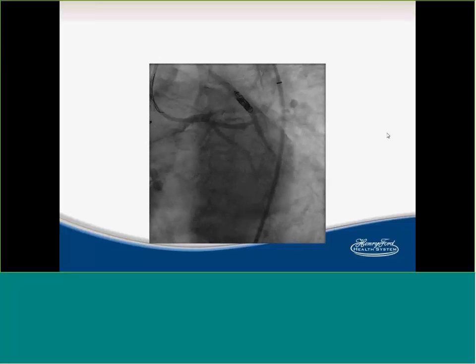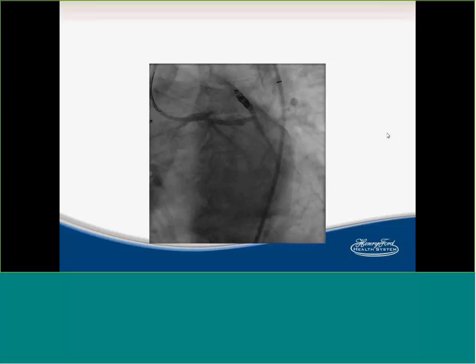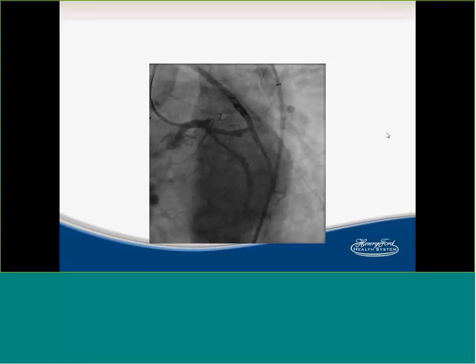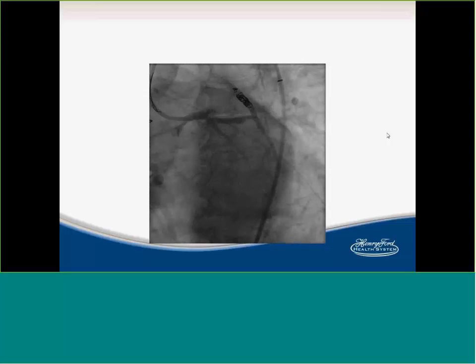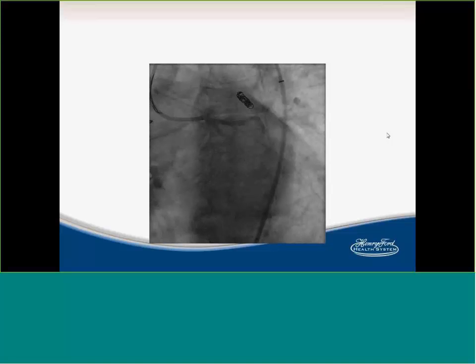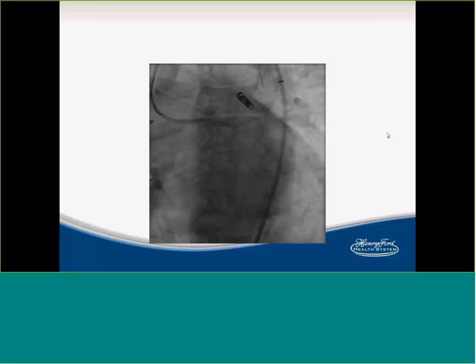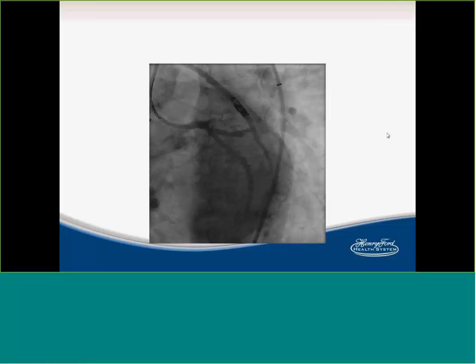Yeah, I think, Carl, this is a great example. I think you mentioned it before to me as well, that at some point in the future, or the present in some centers, this might be the preferred therapy for degenerated vein grafts. Instead of operating on the vein graft, with better techniques and the way you just described very nicely here, maybe that's the better short-term and definitely long-term patency, and less chance of embolization and all these issues you had in this patient.